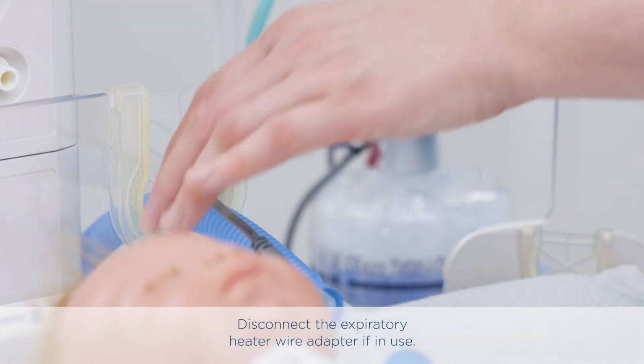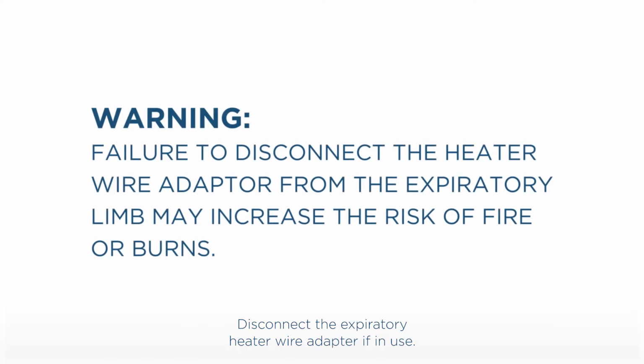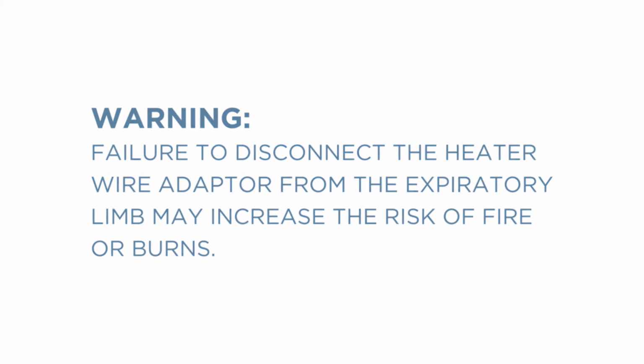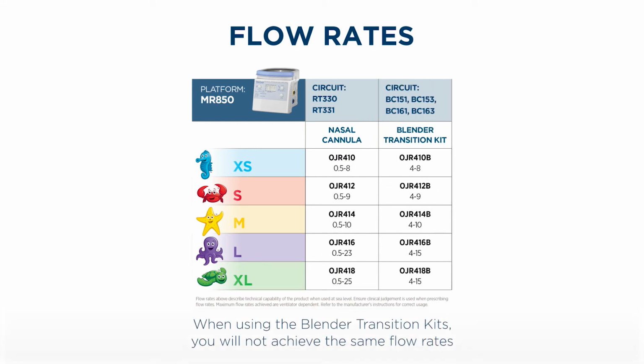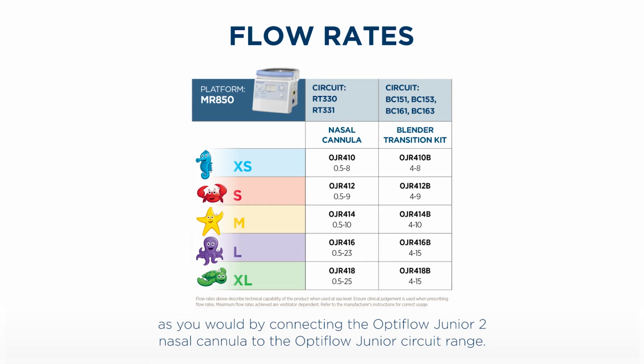Disconnect the expiratory heater wire adapter if in use. Warning: failure to disconnect the heater wire adapter from the expiratory limb may increase the risk of fire or burns. Flow rates. When using the Blender Transition Kits, you will not achieve the same flow rates as you would by connecting the Optiflow Junior 2 nasal cannula to the Optiflow Junior circuit range.